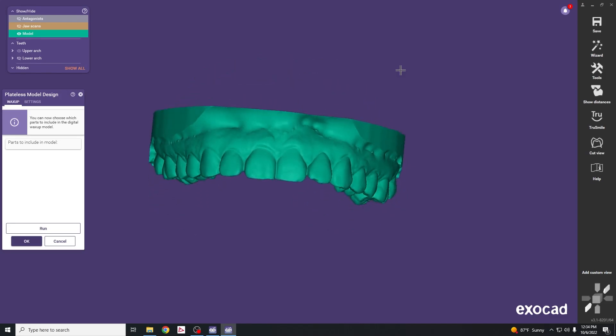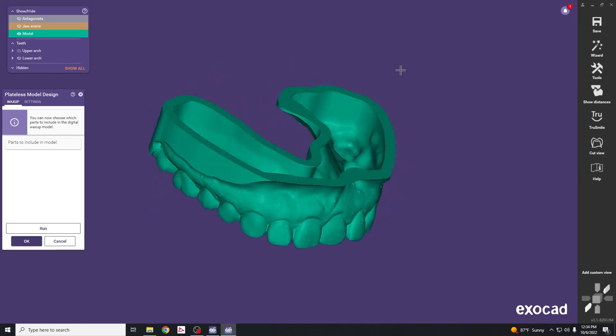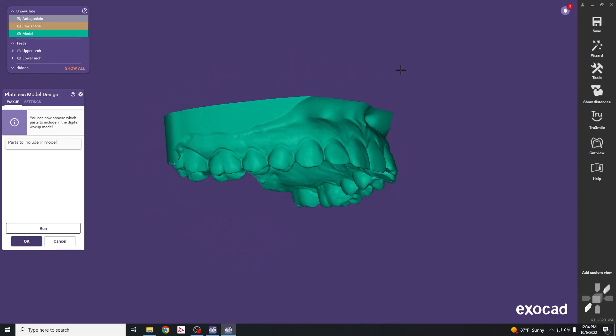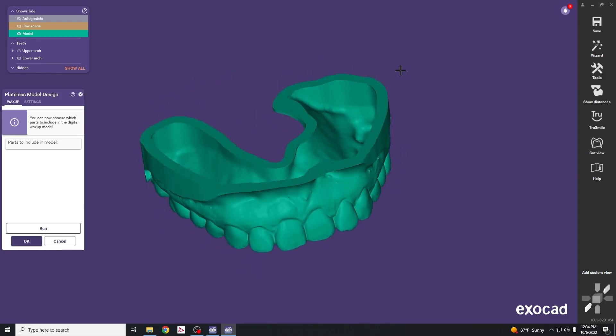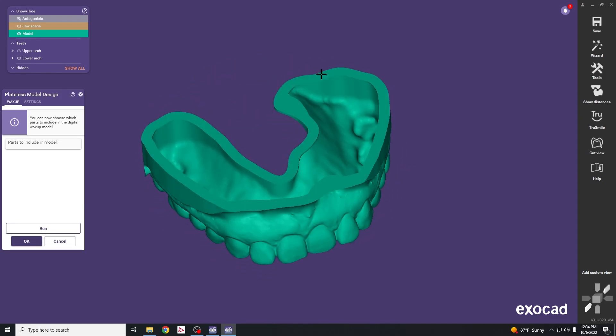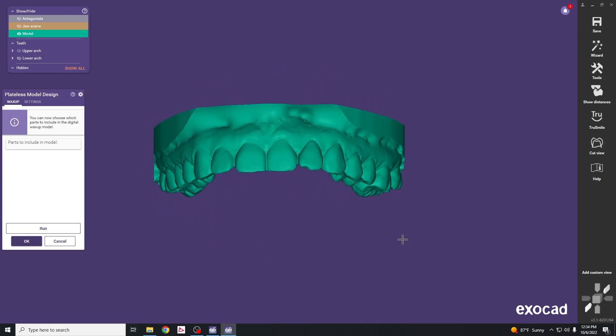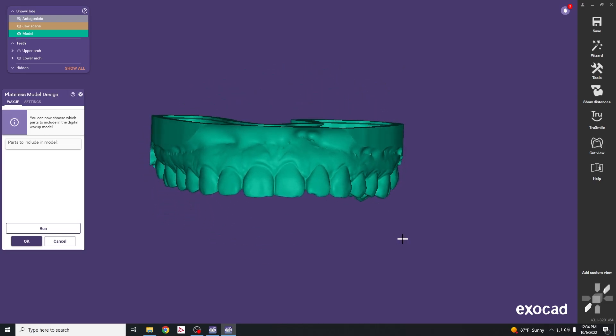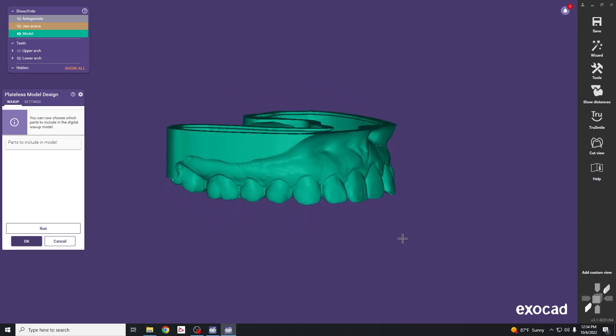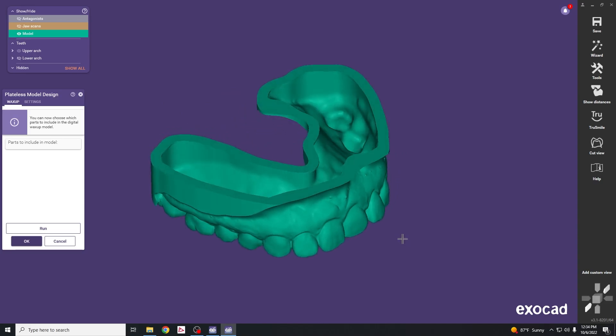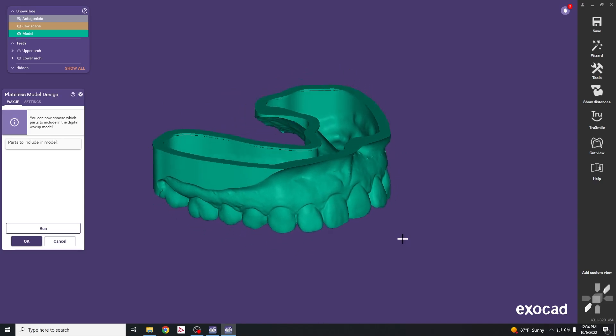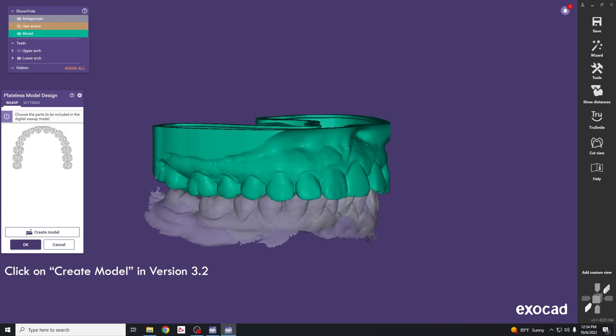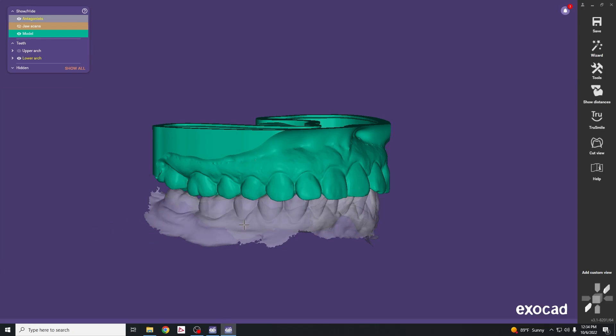Now that this has completed, you can see it has a nice platform attached with a flat side that allows for us to print. This also allows us to mount these models on an articulator if we choose. Hit OK to save the model.